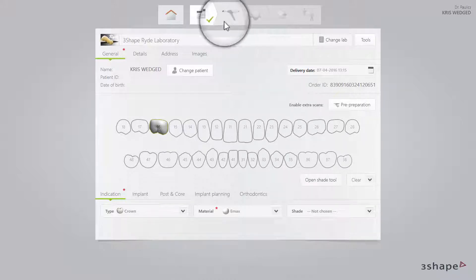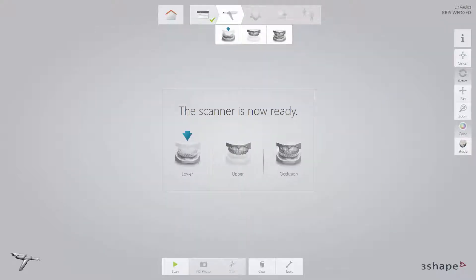Now proceed to the Scan page. Use retraction cord and/or hemostatic agent if parts of the margin are sub-gingival. Start by scanning the opposing arch to allow time for the retraction methods to take effect. As the preparation is on the upper arch in this case, start by scanning the lower arch.